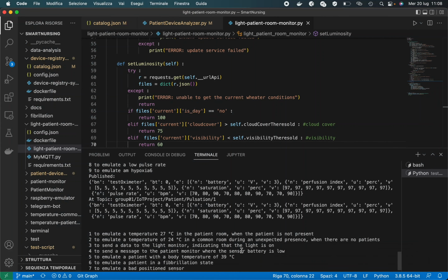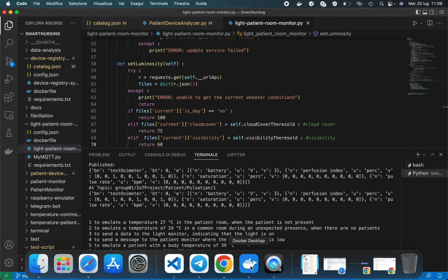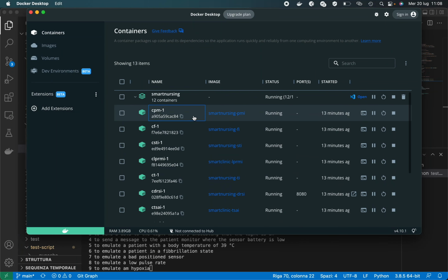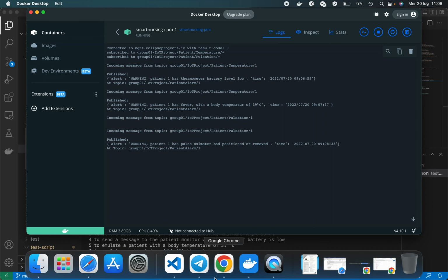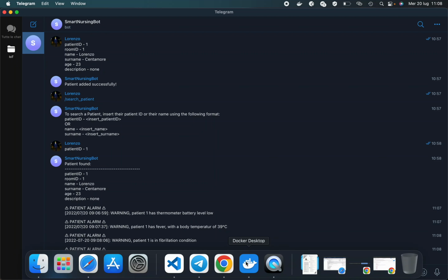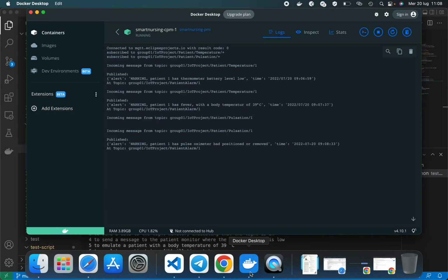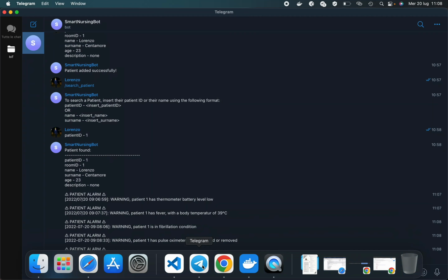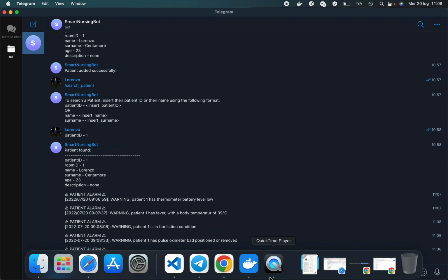Pressing 7, I can emulate a bad position of the sensor, since the perfusion index values are under a certain acceptability threshold. That means that the measures are not correctly taken. Pressing 8, I can emulate a low pulse rate for patient 1. It means that the mean of the heartbeat samples is under a certain threshold. The message indicates also the value of the heartbeat.